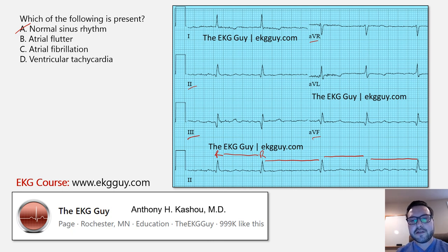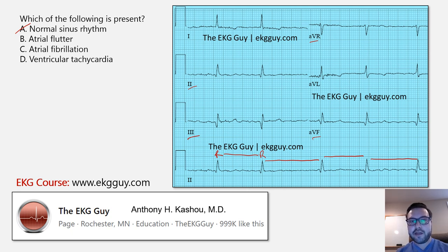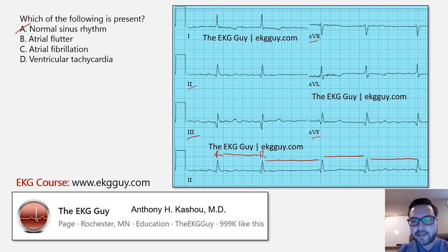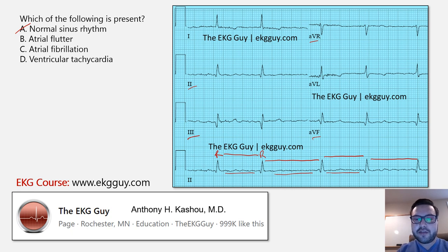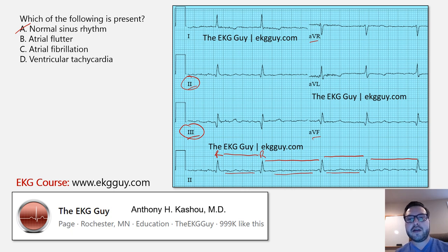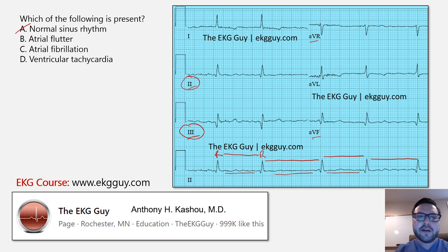Atrial flutter is also an option — you can have an irregular rhythm with variable conduction through the AV node. But that's not the case here. In atrial flutter, you wouldn't see these disorganized P waves. You'd see more regular flutter waves, which may be inverted or upright, typically best seen in leads 2, 3, and V1. V1 is not shown here to help make out the regularity of flutter waves. So atrial flutter is not present in this case.